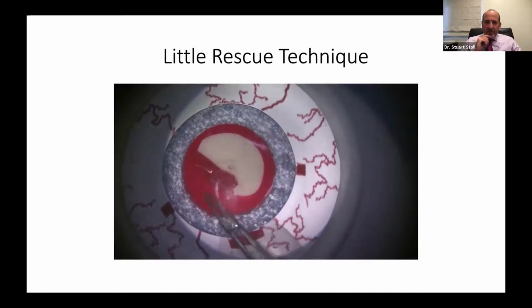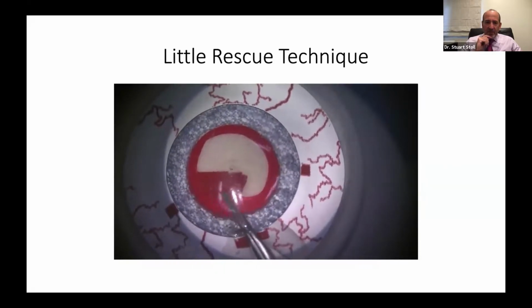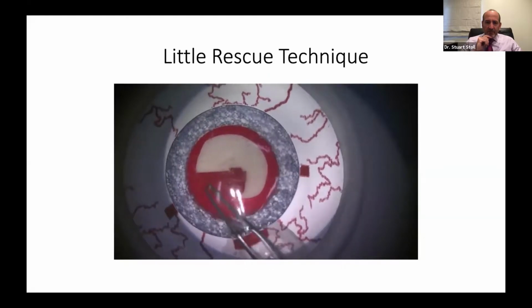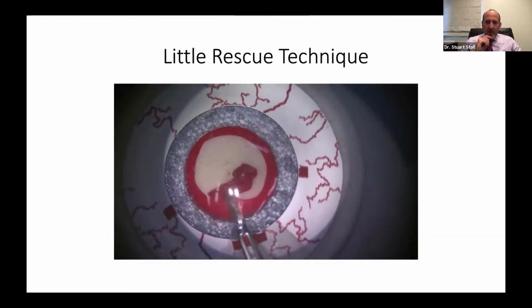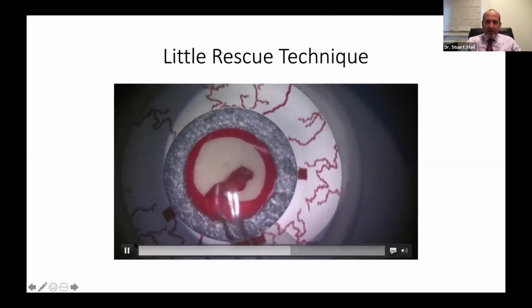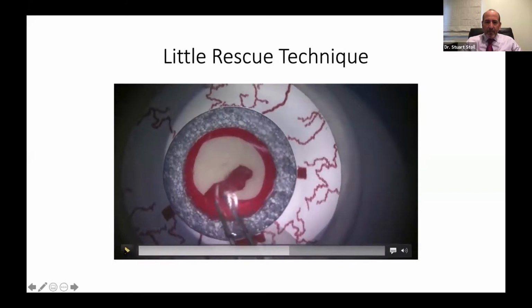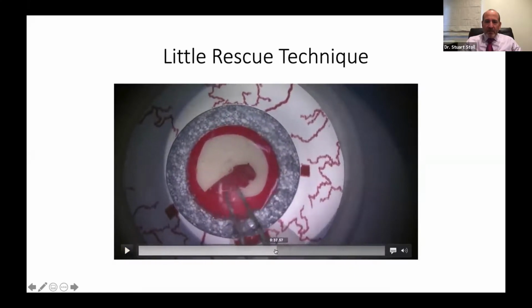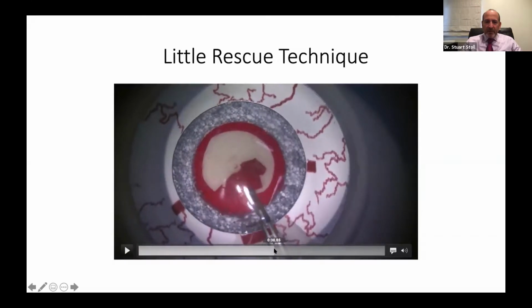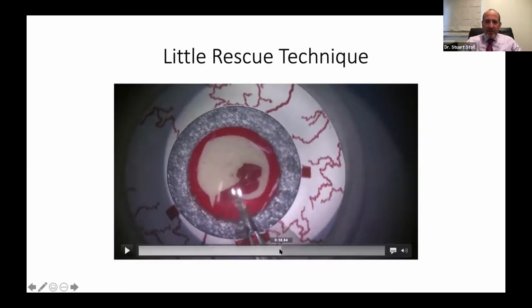So now, we're going to continue along, right? Tension's off, now tension's on, continuing around, struggling a little bit. Oh, what just happened there? My goodness. So let's back up and see what happened there. It's a subtle mistake, but watch what happens. So as we continue on the tear here, we're almost finished, but the finish line is right there.